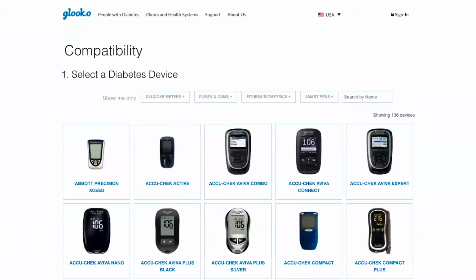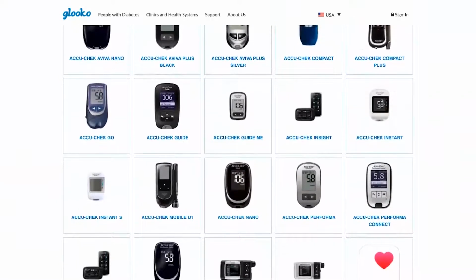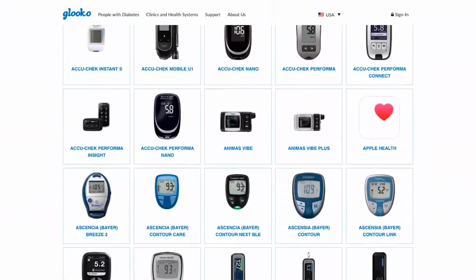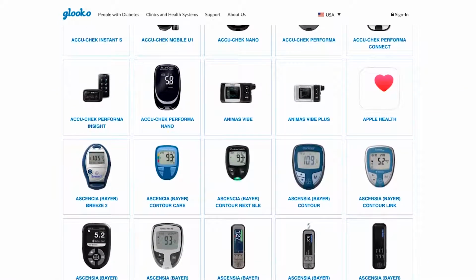Today, there are over 250 diabetes devices in the market, each with their own set of software visualizations, reports, or in some cases, devices without any analysis tools outside of the device itself, leaving a patient's care team to reorient and constantly adjust in order to analyze the data from the disparate manufacturer devices and systems for reports.